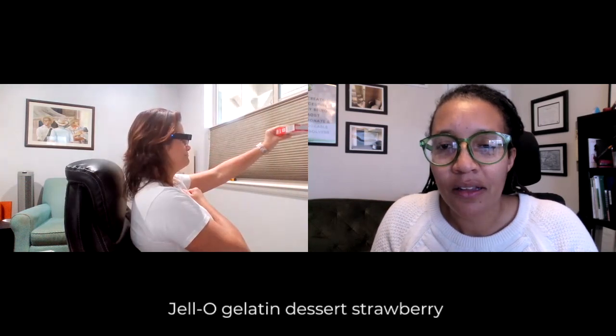I'm going to try with something else. Let's see if it picks it up. Gelatin dessert strawberry. Did you hear that? Yeah, it said Jell-O gelatin flavor strawberry. So we even got the flavor, because even if I know that I put all my Jell-Os in one spot in the cabinet, I might not know that this is strawberry and this one is cherry. Exactly, that's important. So that was really easy.